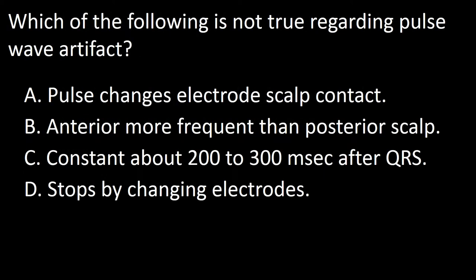Next question. Which of the following is not true regarding pulse wave artifacts? A. Pulse changes electrode scalp contact. B. Anterior more frequent than posterior scalp. C. Constant about 200 to 300 milliseconds after QRS. D. Stops by changing electrodes.